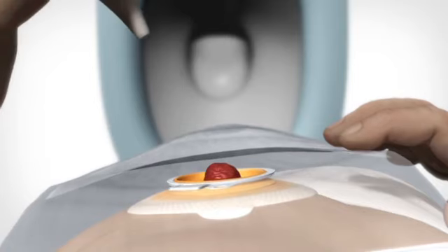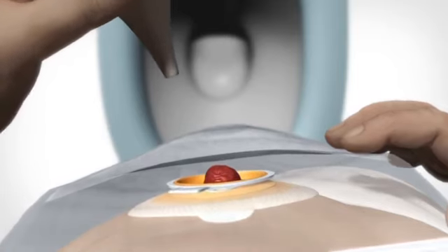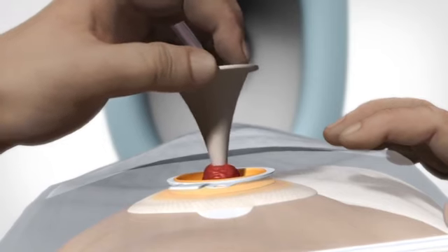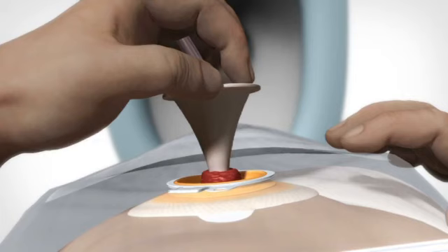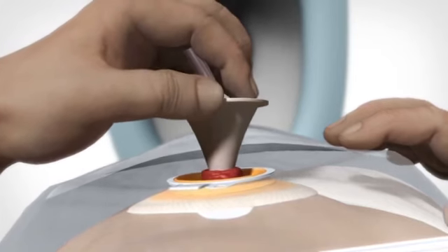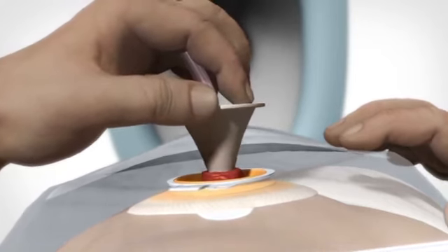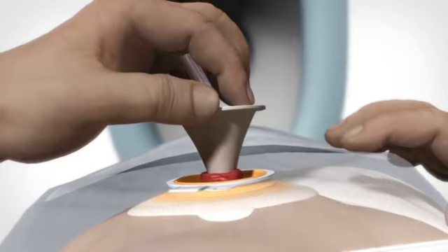If necessary, lubricate the cone with water before use. Then insert the tip of the cone in the stoma through the top of the sleeve. Keep the cone in the right position in the stoma with one hand. You might want to wrap the top of the sleeve around the tube to avoid potential soiling.